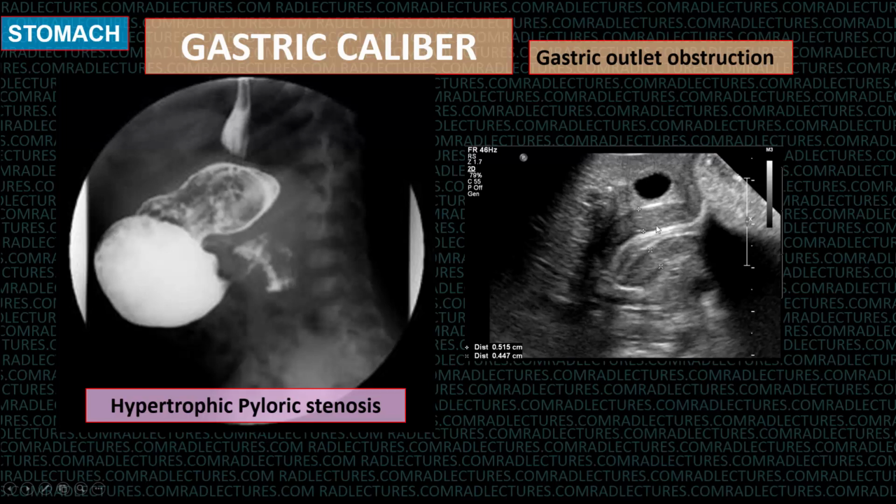And that is the way of looking for the hypertrophic pylorus in a child in whom you are suspecting hypertrophic pyloric stenosis. It is usually done with the stomach full, or the baby can be feeding, so they are pacified, and also it helps in differentiating the pylorus from the rest of the stomach.